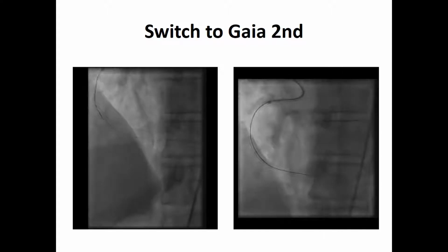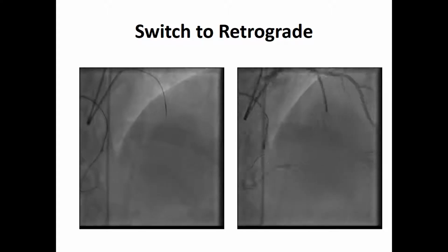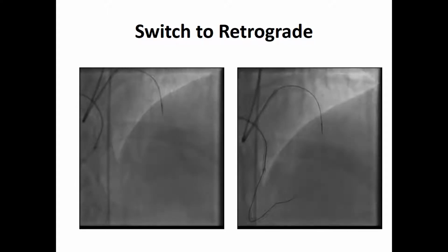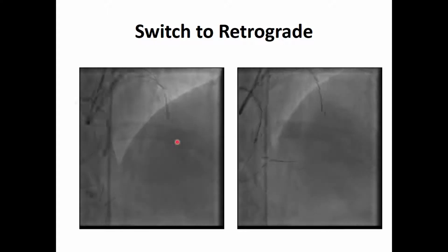Here is a distal tip injection, and we don't see any connections from that septal we injected to the RCA. We were able to find other connections. However, those connections, as you saw, brought us very close to the distal part of the distal cap of the CTO, and we are not in the lumen of the PDA. So it's not a good connection. If we take these connections, we will exclude the distal target of the vessel. So we postponed and aborted the retrograde approach, and we came back again to the antegrade approach.